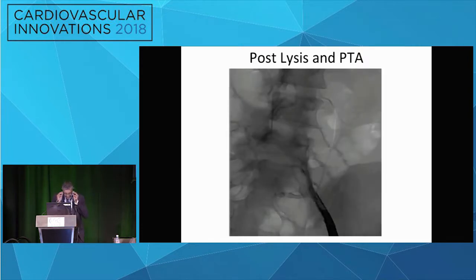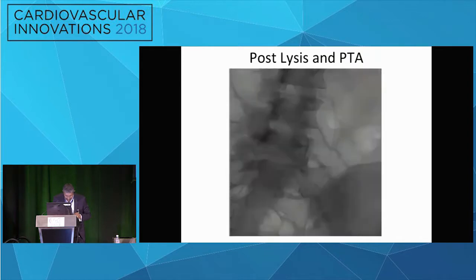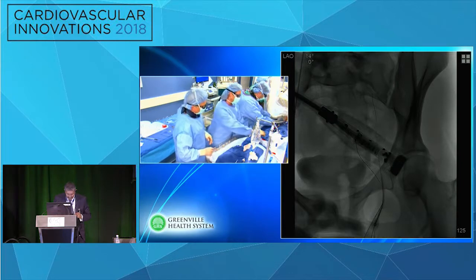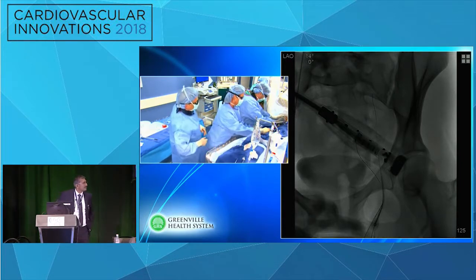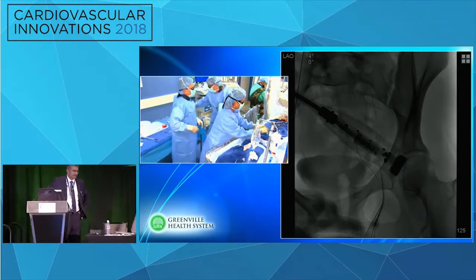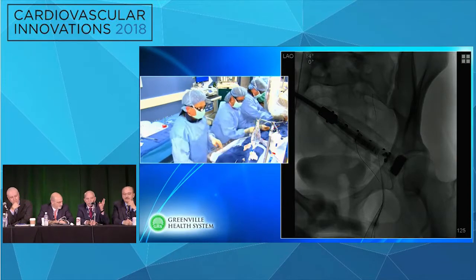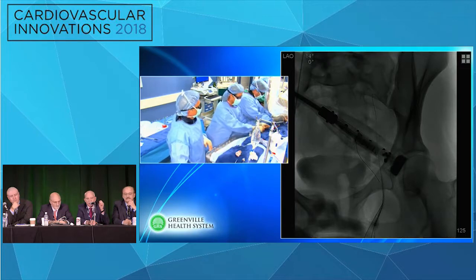Mike Backrack, back live here. Good case. Good to hear from you. Hey, Mike. You know, I think there are a couple of things. I agree that stenting would have been certainly appropriate at that time. It's likely that this is a May-Thurner physiology, that in fact that vein is very sclerotic, and the likelihood that angioplasty was going to work alone, at least in my experience, has not been borne out. So I think that was a faux pas on that part.